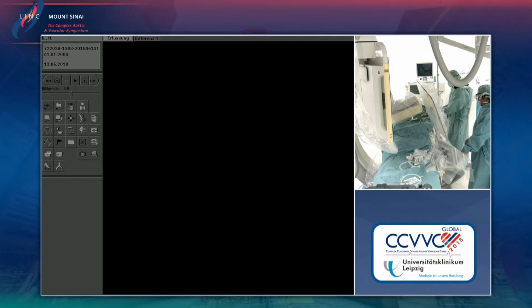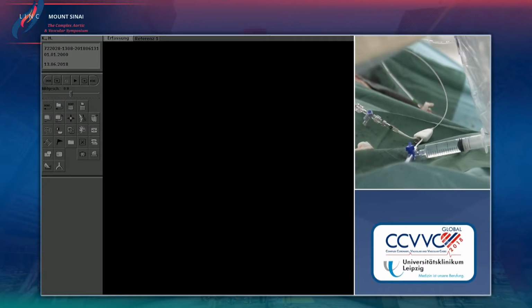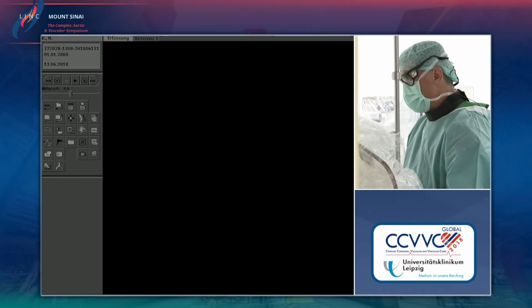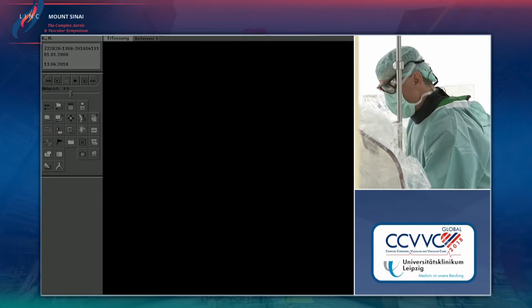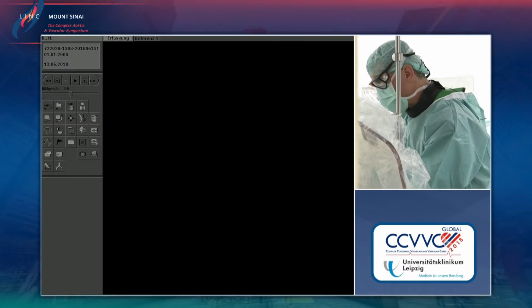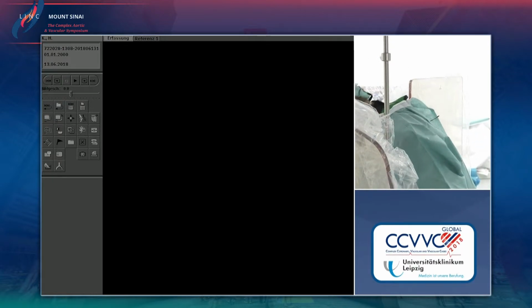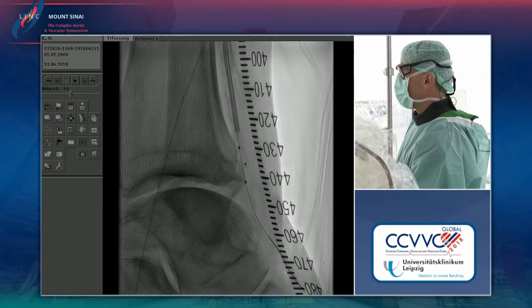Yeah, so actually for the bullfrog we usually do not use a ruler, because with a mix of dexamethasone and contrast you actually can see quite nicely how far that mix spreads proximal and distal, although it also spreads over time, not immediately to the full length. It is actually rather for the following treatment with TAC systems. There I think you definitely need the ruler to orientate.